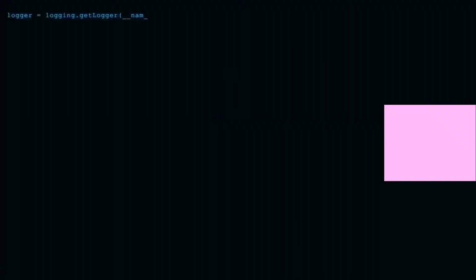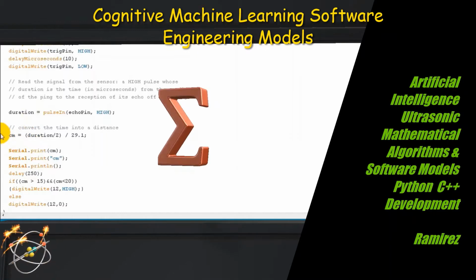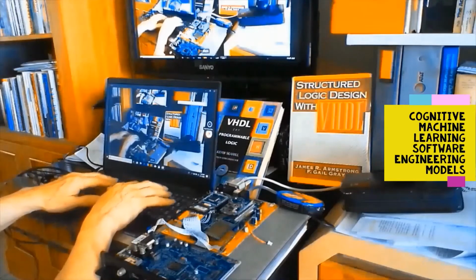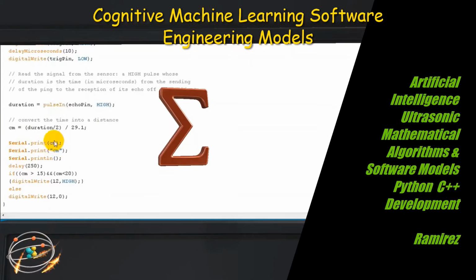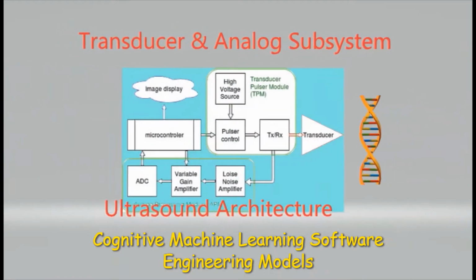The analog to digital converter is required for the digitization of such signals. This implies that an analog envelope detection has to take place within this module, in order to facilitate this processing.